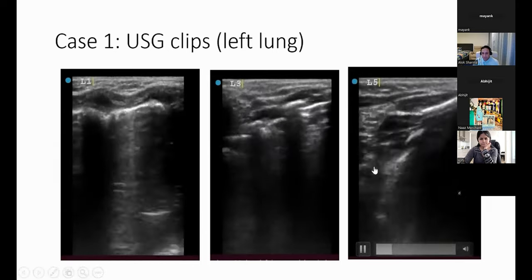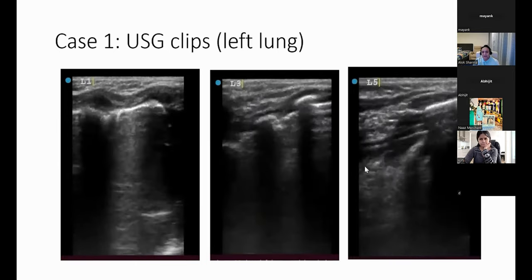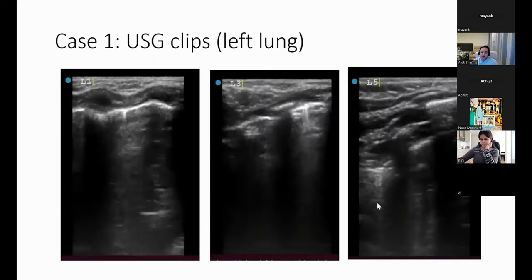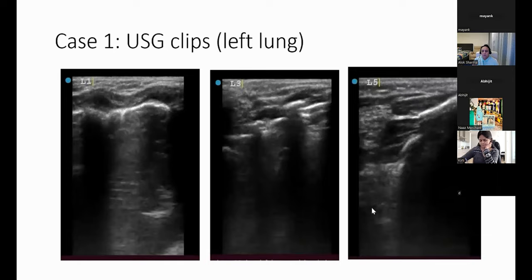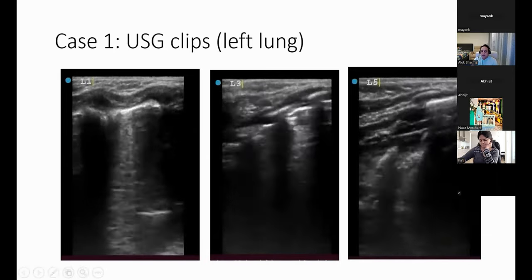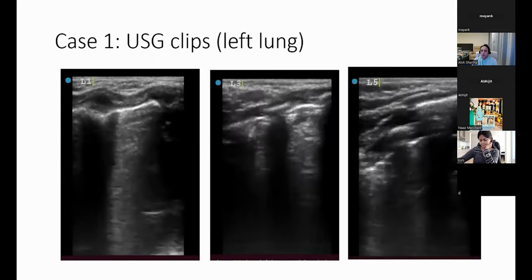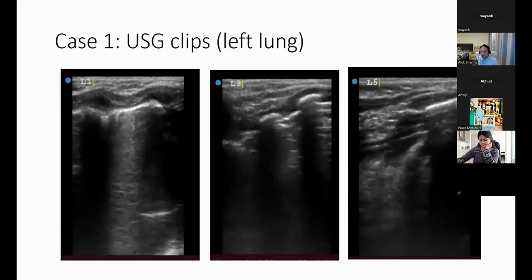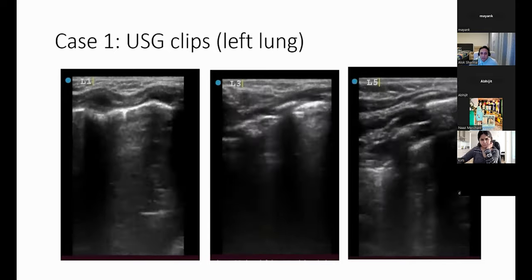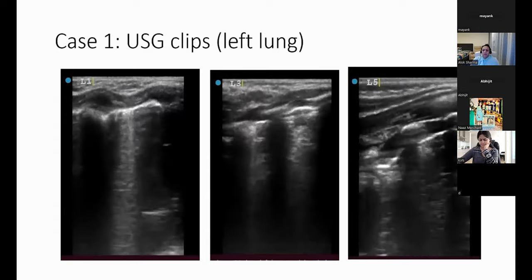Now, if your baby's moving, the question is, are you applying too much pressure? I suspect to try and better your image, you're applying a lot of pressure, which is why the baby is recessing more. When you put the probe on, the weight of the probe should be completely off the baby. It's mere contact that you want. The more you struggle with image resolution, the harder you press, the more difficult it will be to get images. Your L1 image is beautiful. L3, L4, good. But we can make it a little bit better by those changes.